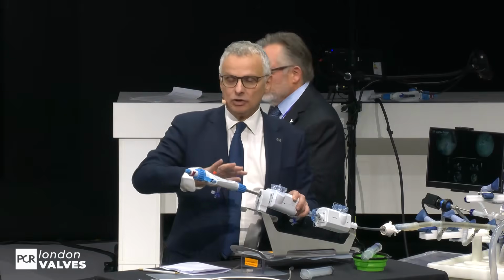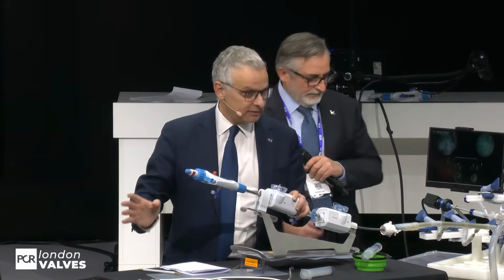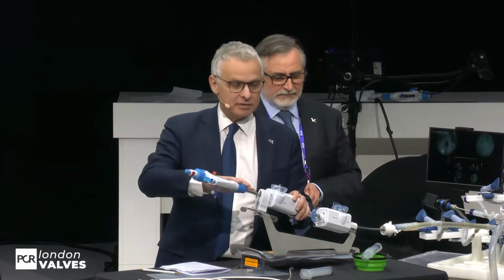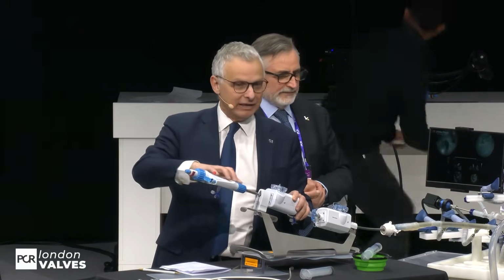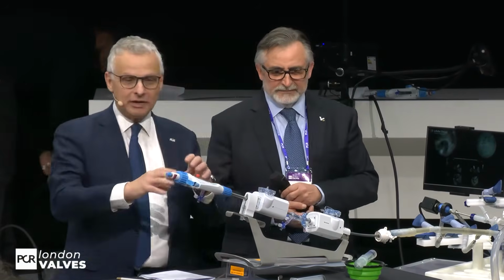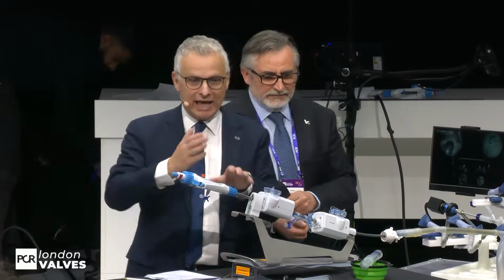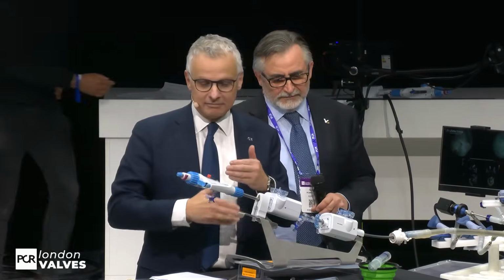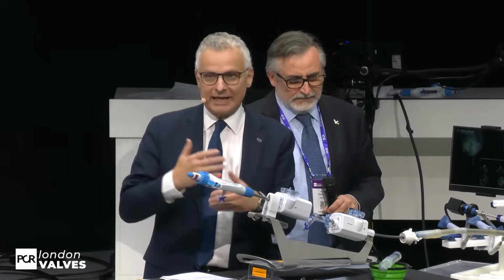Anyhow, with G5, basically there is no difference in the implant, but some differences in the delivery system. What is the main change? There is no more decision making. Everything is very structured and, let's say, more repeatable and learnable.